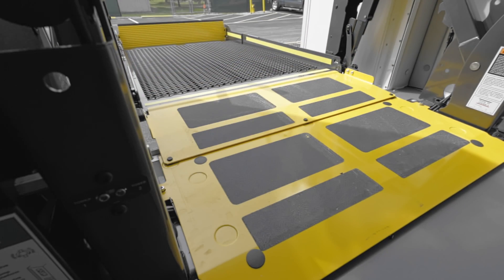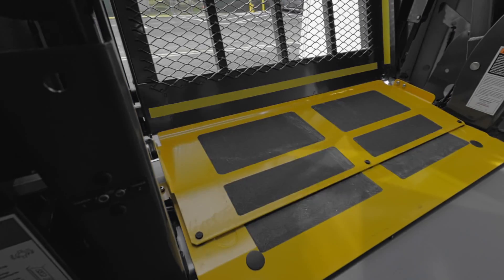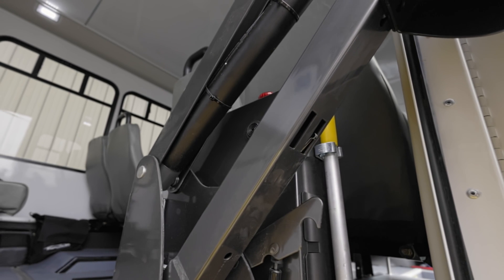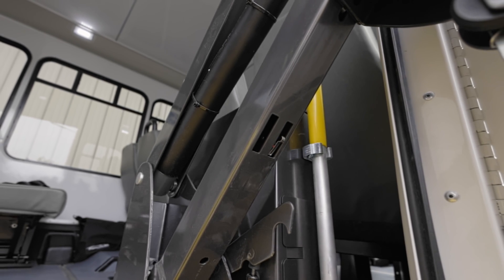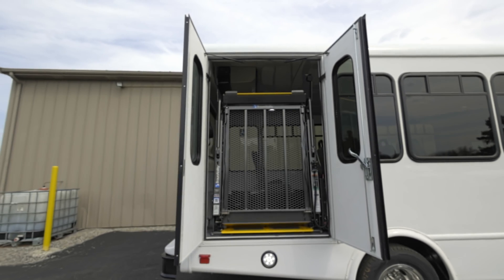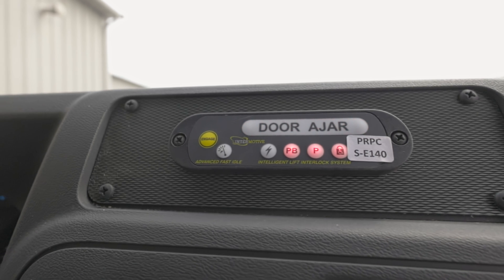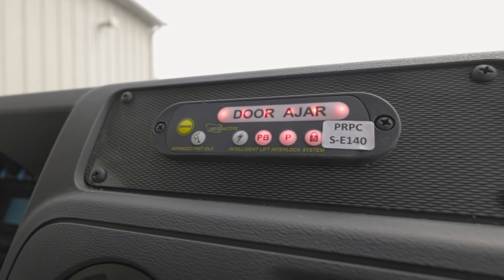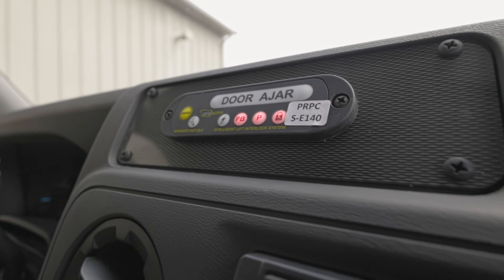The metal plate leading inside is also pressure and weight sensitive, making sure the lift is clear before operation and movement. Both lift arms on either side also feature sensors to ensure the lift is fully down or folded up completely. The doors also have sensors to determine whether they are opened or closed, using the interlock system to disable the ability to release your parking brake and drive away. If you have trouble operating or enabling the lift, it is worth checking these features to troubleshoot if proper procedures described earlier are followed.